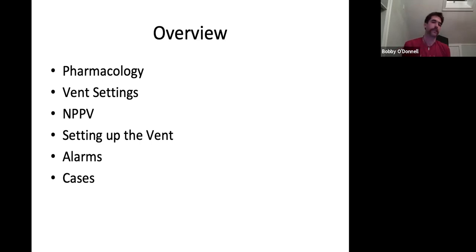Maybe we just look at creating a new vent sheet that has everything we want on the CQI module, and then you can just check all that off and scan it in, and we'll have everything we need. Would that be a reasonable solution for people? Would that maybe make it a bit easier? And then exactly what to check, and it streamlines everything that I kind of want and need.